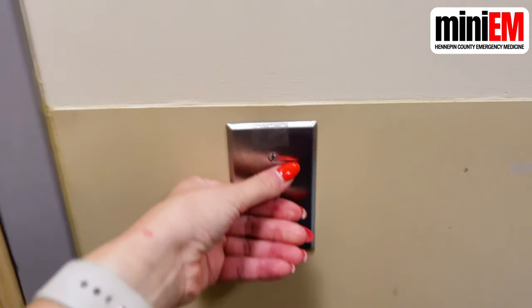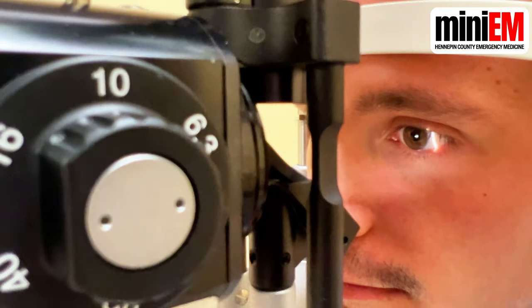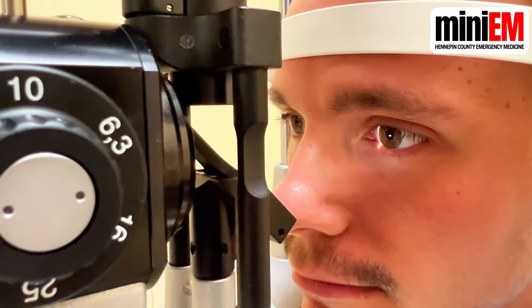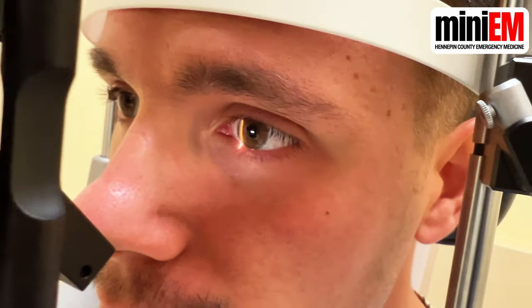Now you're ready to examine your patient. Start with a general scan of their eye from outer to inner corner. Examine their lids, lashes, corneal surface, sclera, conjunctiva, pupil, and iris.